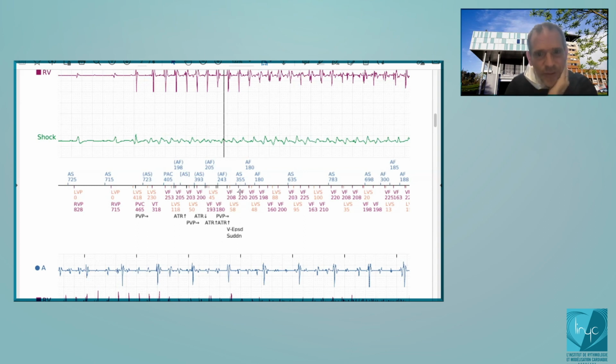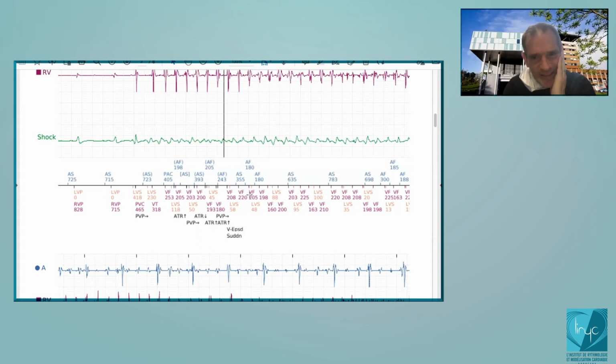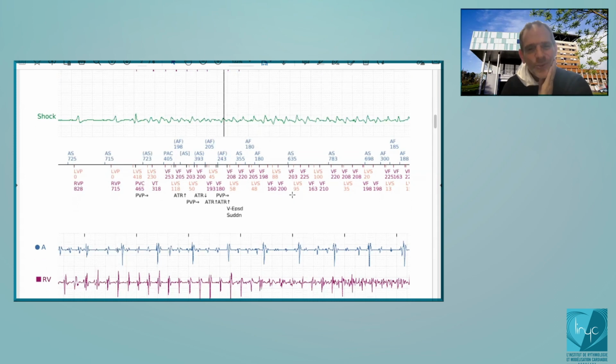You now have the 8 out of 10 for the VF zone. You understand? And then on this cycle, in parallel with the duration for the VT zone, we start the duration for the initial detection of the VF zone. You understand? Yes. Okay, so at this time you will start the duration.